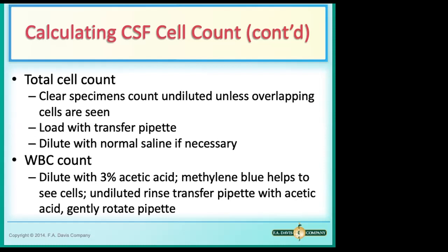When you do require a dilution, you have to use a calibrated automatic pipette, and use the right dilution factor and make sure that you add the dilution to your formula so that you get the accurate amount at the end after you've calculated your sample.